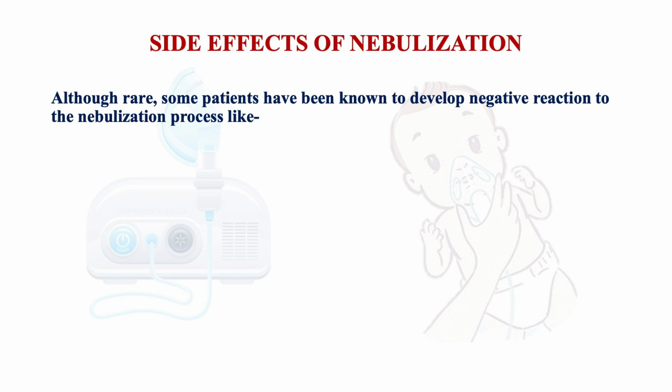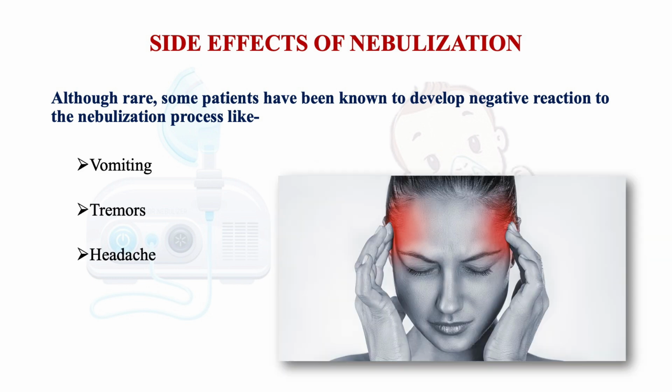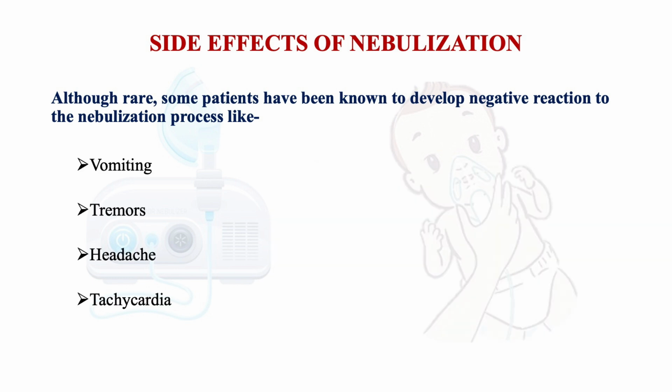Side effects of nebulization. Although rare, some patients have been known to develop negative reaction to the nebulization process like vomiting, tremors, headache, tachycardia and bronchospasm. So, these are the side effects, though rare but may develop in few patients.